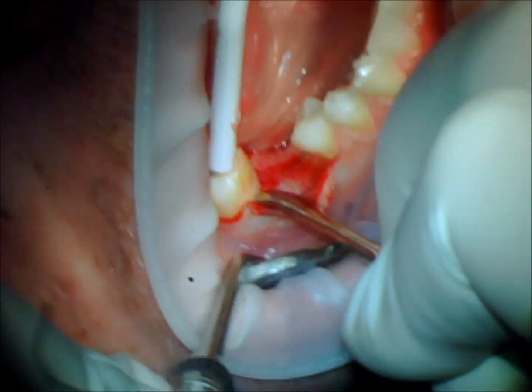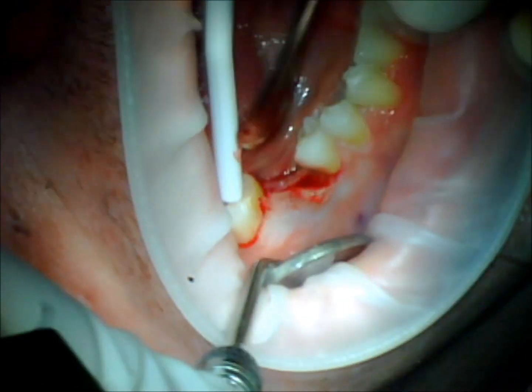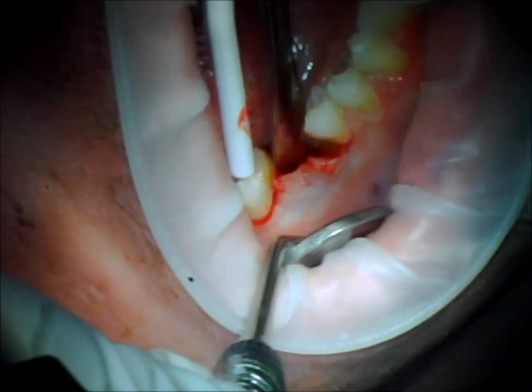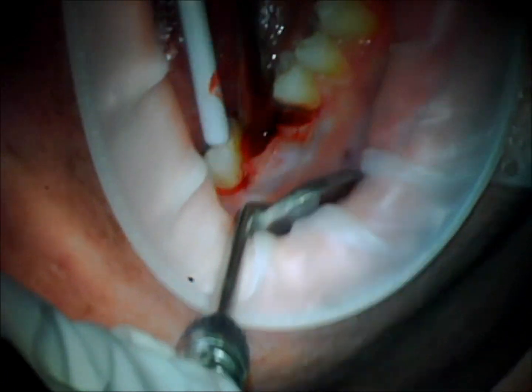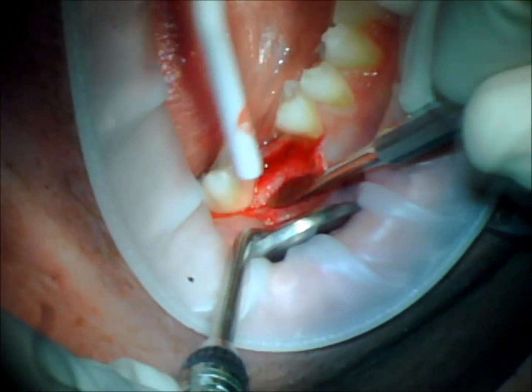Excellent. And like I anticipated, that looks like it's very good quality bone, even though the cone beam might not suggest that. So no need for a really big flap — just big enough to expose the crest.